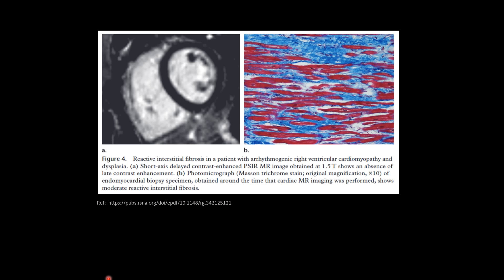Here is an example: this is a late gadolinium enhancement image and we are not seeing much enhancement, but on histopathology there is significant fibrosis. Sometimes when diffuse fibrosis occurs, the enhancement might not be obvious — there may be very subtle enhancement and we won't be sure whether it is enhancing or not. In such conditions, if we do T1 mapping, the mapping values will be high.